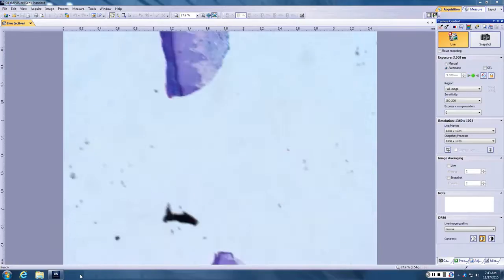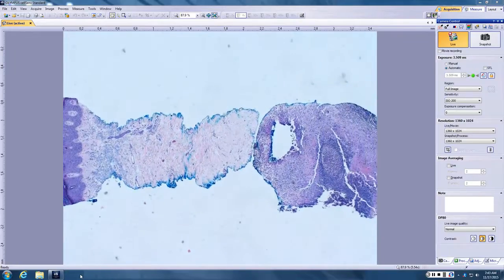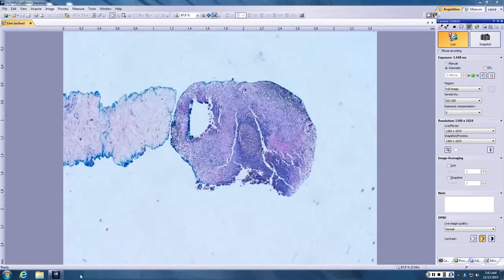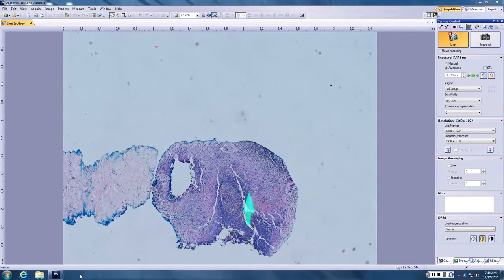How old or young is this person? Old. Judging by the solar elastosis. Okay. What else do you see? So, there's a really deep, what looks like a pretty robust inflammatory process, pretty much spearing the whole dermis, very deep in the dermis. Okay, so at scan, what kind of cells do you have on the outside?